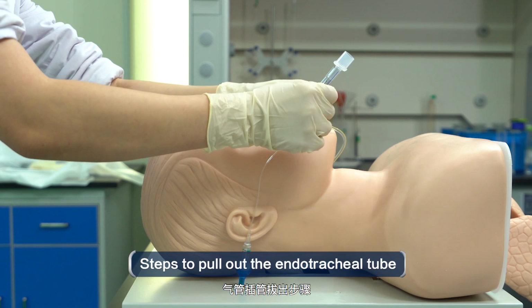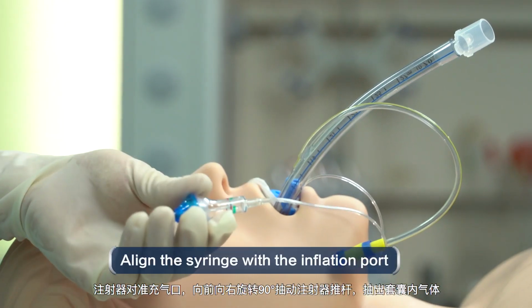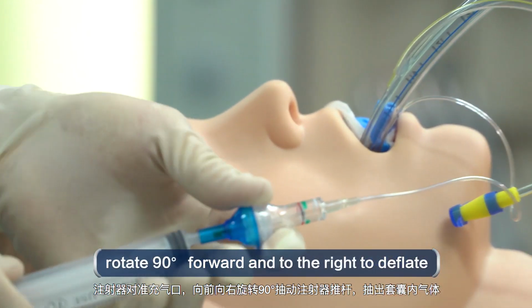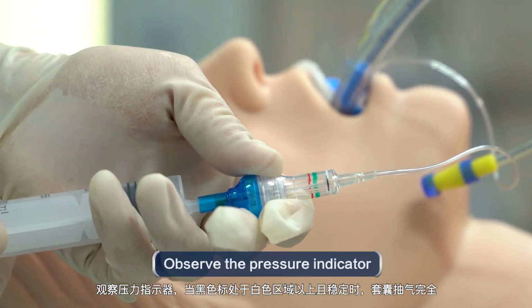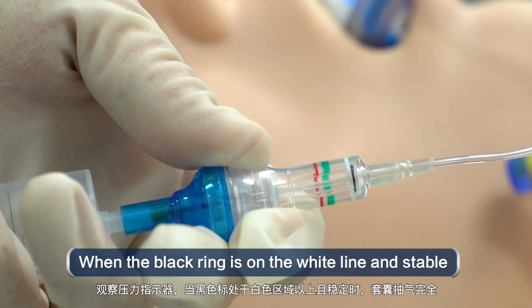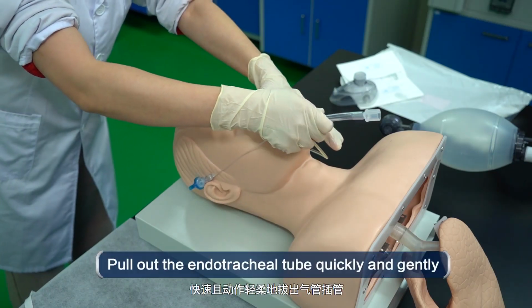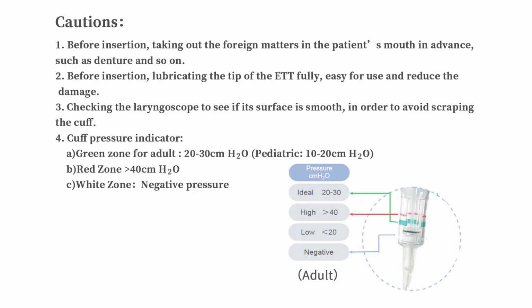Steps to pull out the endotracheal tube. Deflation. Align the syringe with the inflation port. Rotate 90 degrees forward and to the right to deflate. Observe the pressure indicator. When the black ring is on the white line and stable, the deflation is complete. Pull out the endotracheal tube quickly and gently.